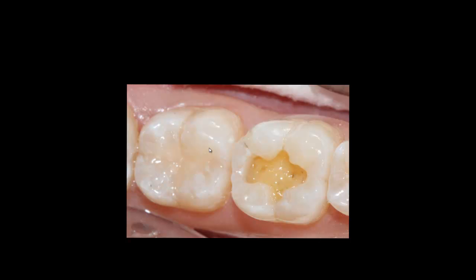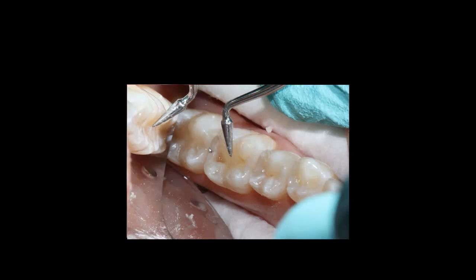I use some Hue 3D carving instruments and cross-arch cusp techniques to sculpt and define the anatomy of number 30 — creating the grooves and shaping the slope of the cusps — making sure there is no tension after curing. After developing the anatomy, I cure this first layer.